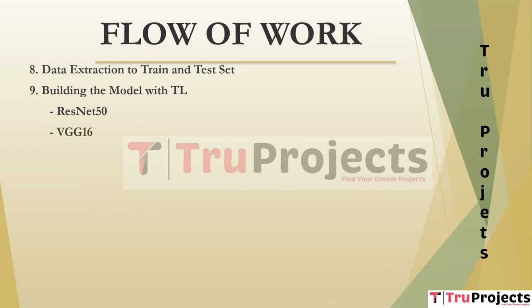VGG16. It is another type of pre-trained deep CNN architecture, specifically with 16 layers. It is fine-tuned through transfer learning for improved performance in thyroid nodule classification. MobileNet. It is a lightweight and efficient CNN architecture designed for mobile and embedded applications. In this project, it is adapted through transfer learning to the thyroid nodule classification task.